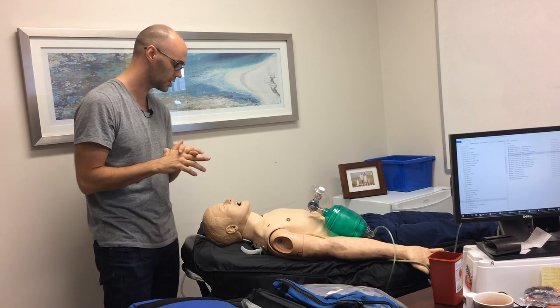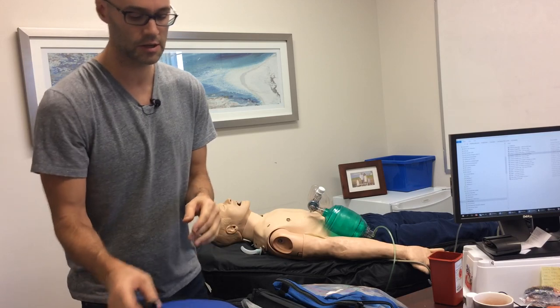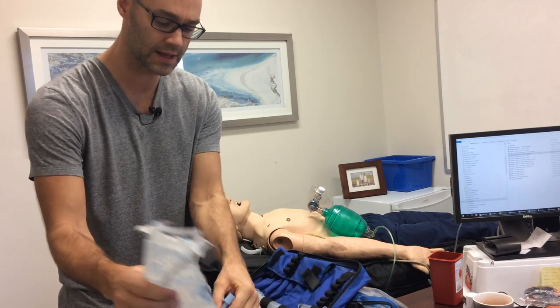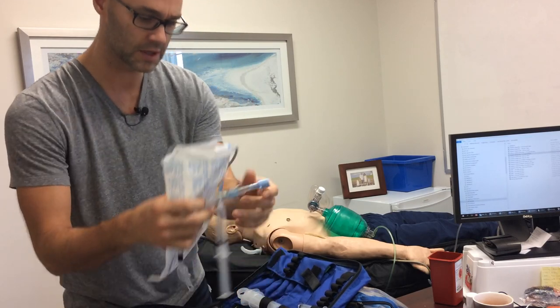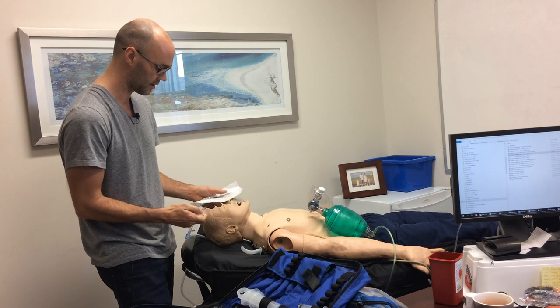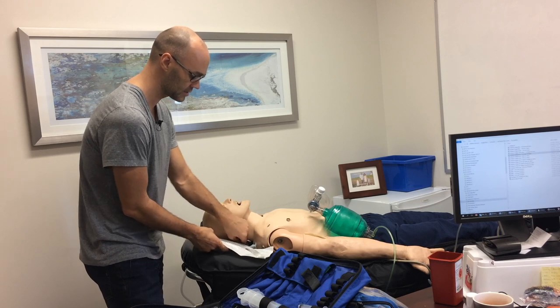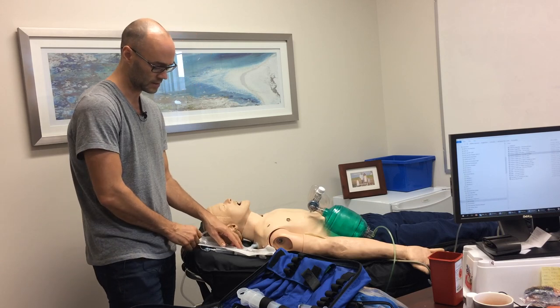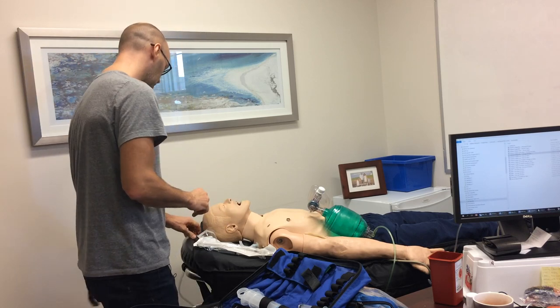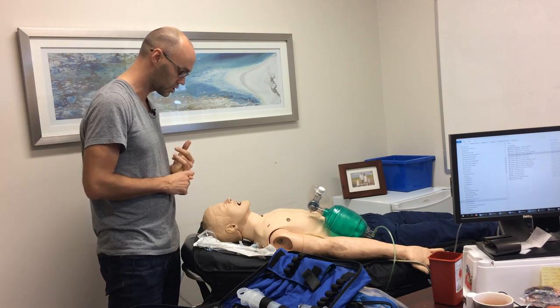My patient's now pre-oxygenated. I'm going to make sure I prepare my equipment and go through my plan. I'm going to haul out my intubation kit and go through STOP. Stylet and tube: I'm going to take an appropriate size tube and one size smaller. We'll check the cuff and see if it's intact, which it is. We can leave the syringe attached. Put in a stylet into the tube, bending at a nice angle. Suction — I've got suction under the patient's head available to me as I need it. We have our tube already.